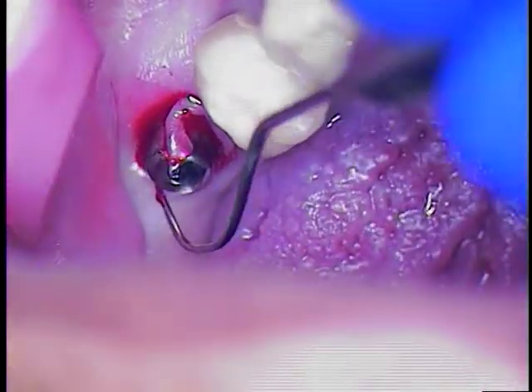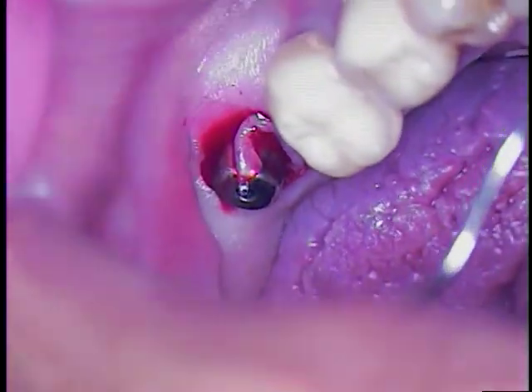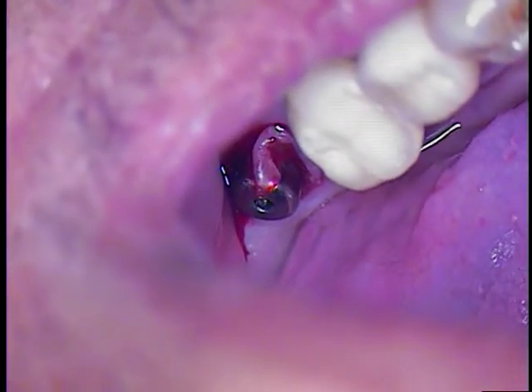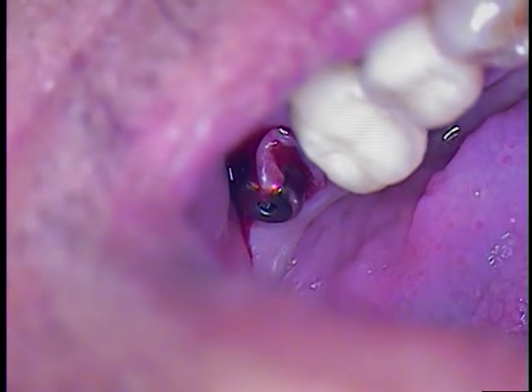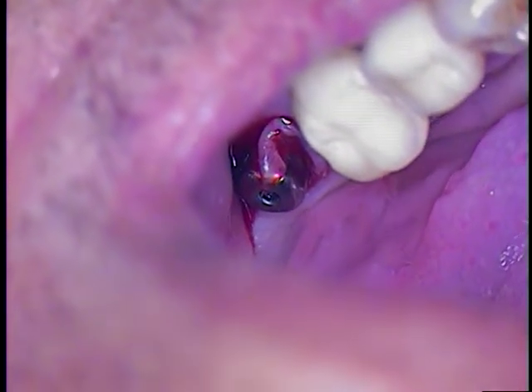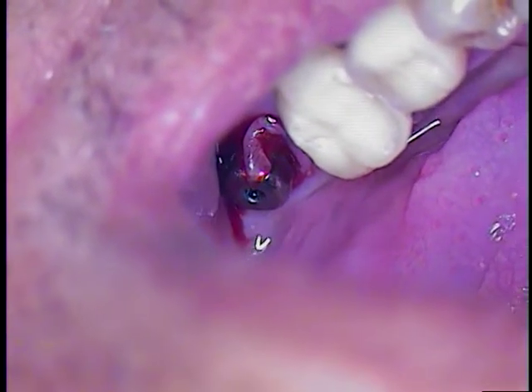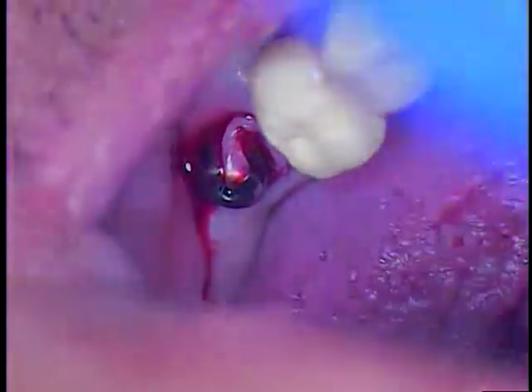Let's see where the rim is. Any swab — switch up to this surgical suction right here. I'm going to use a scaler, and now we'll go ahead and just suction that all up.